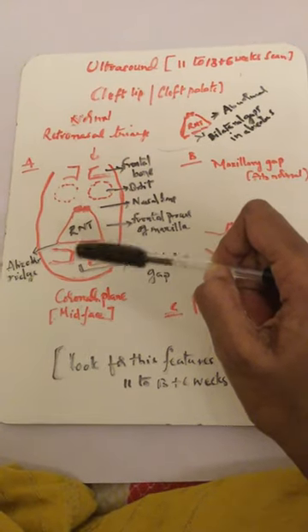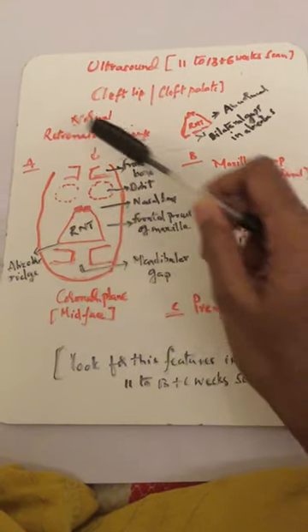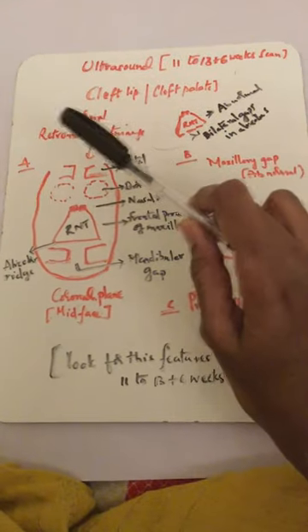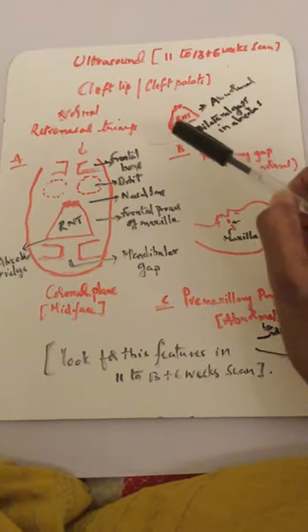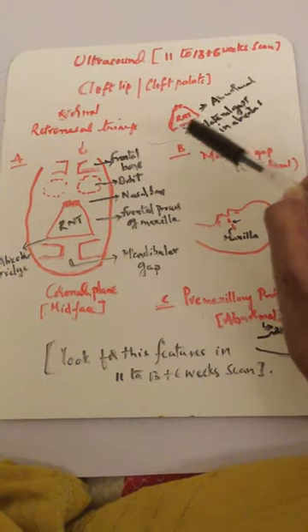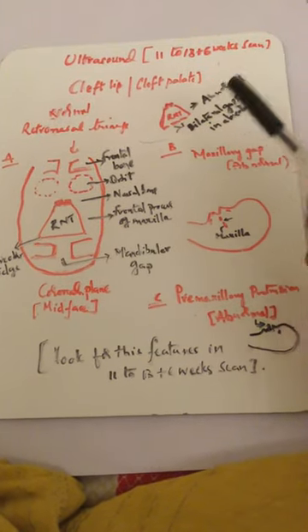This is a coronal plane midface. If these features are present, this is normal. When do you tell it's abnormal? When there are gaps between the alveolar ridge, then you identify it as abnormal and you have to rule out cleft lip or cleft palate.